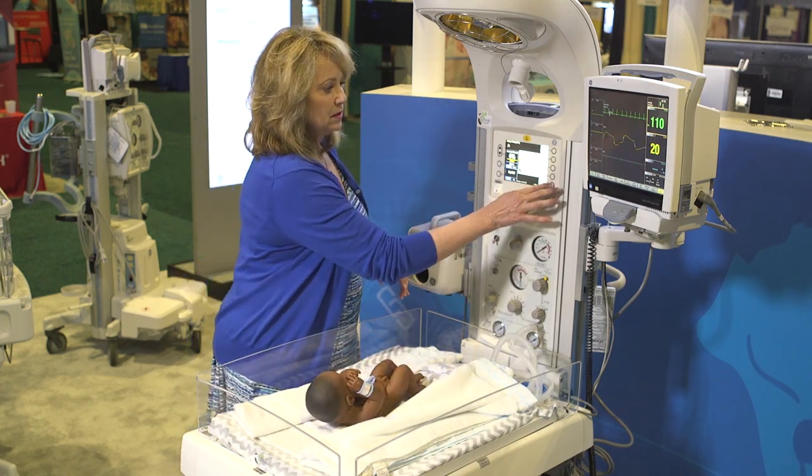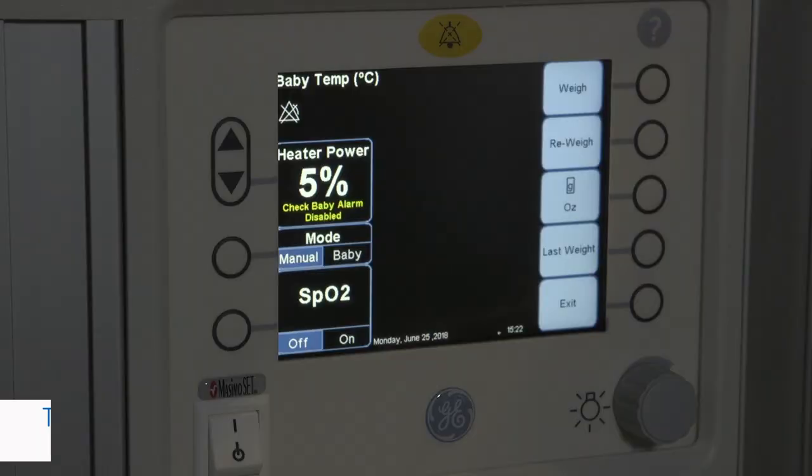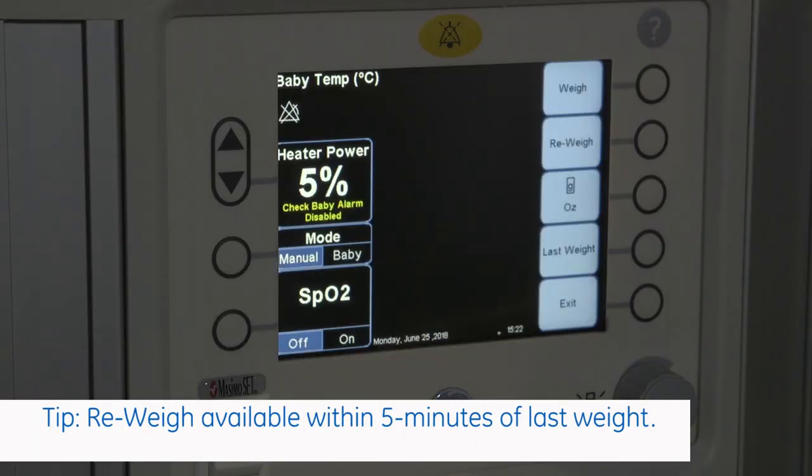You can re-weigh if you need to, or you could obtain your last weight from the bed.